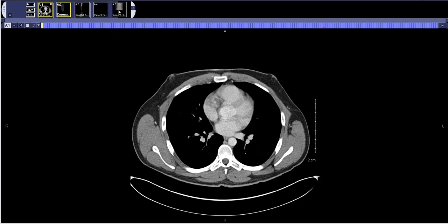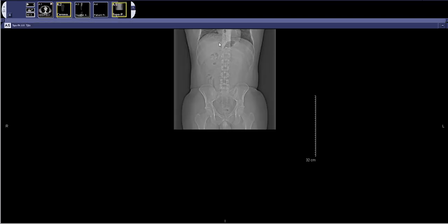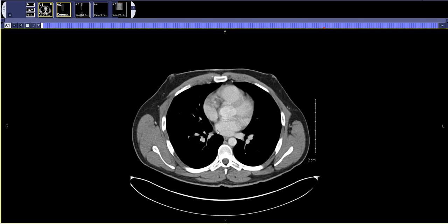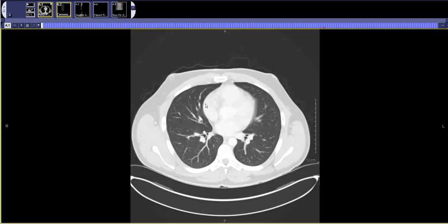The first thing I do after I look at the scout film is I look at the lung bases. So I switch to lung windows. I scroll up and down generally four times through the lung bases. I look at the anterior right lung, posterior right lung, anterior left lung, posterior left lung.